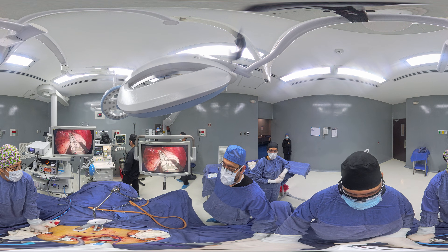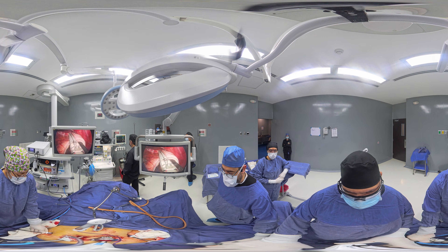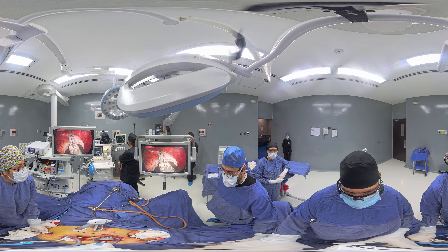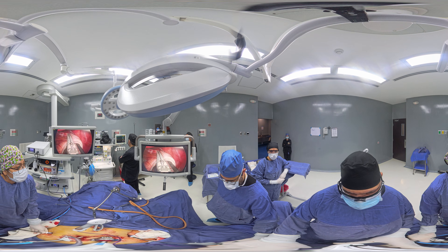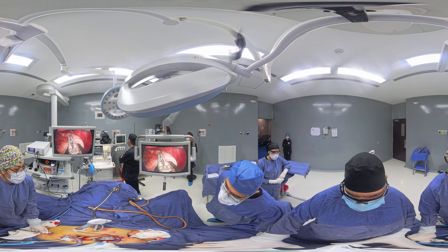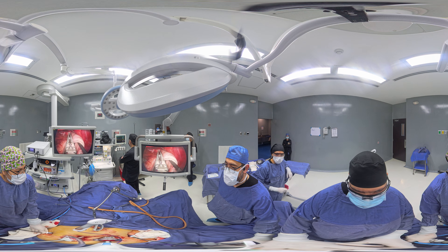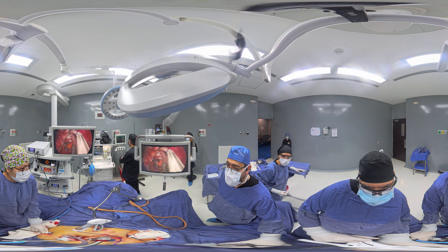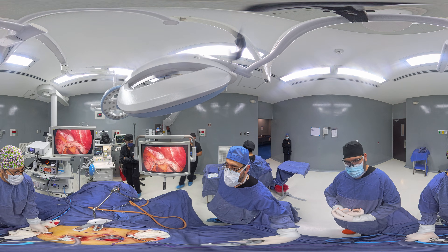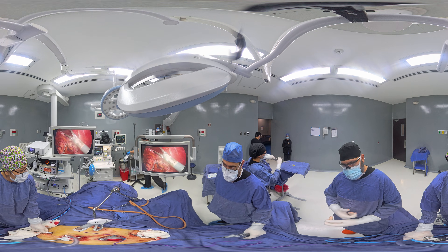Everything's safe at this point, so I'm just waiting for the heart rate to go up and then I will proceed and take advantage of this compression on the stomach. All right, good to go. See how those numbers don't go down anymore — they're actually going high. Safe. Now we're missing one more cartridge, one more load, and we will be finishing the section of the stomach.